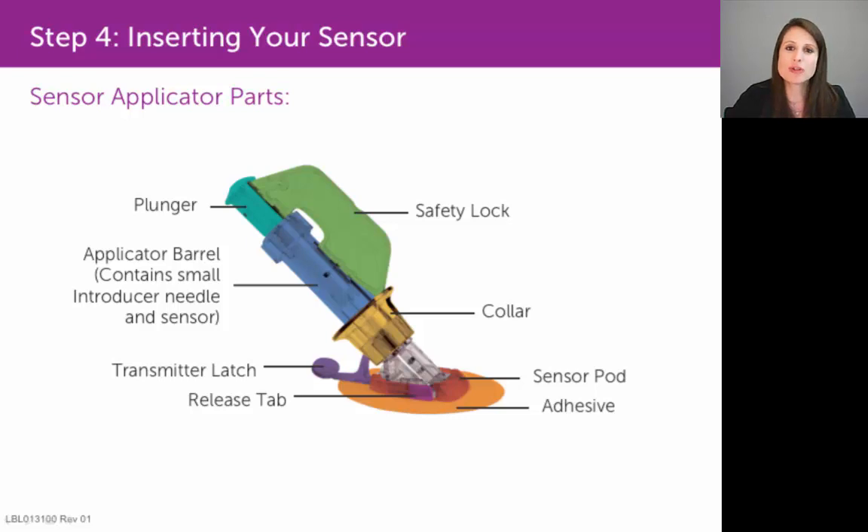You also want to be very careful as to where you place your fingers in relation to that collar during the insertion. You want to keep your fingers above the collar when you depress down on the plunger with your thumb. That's very important because your natural instinct will be to put your fingers below that collar initially.